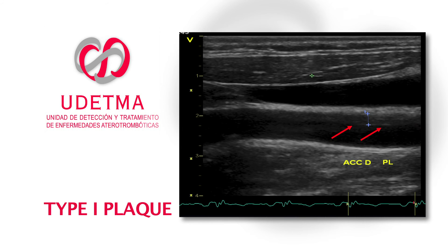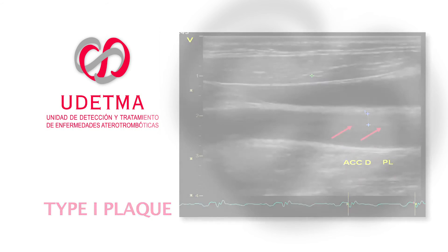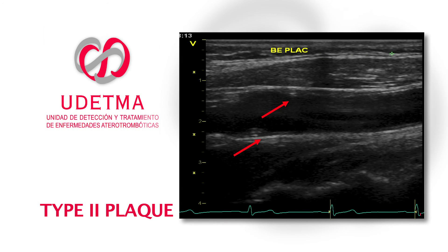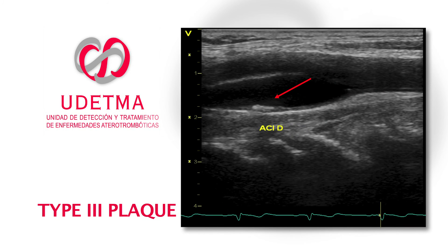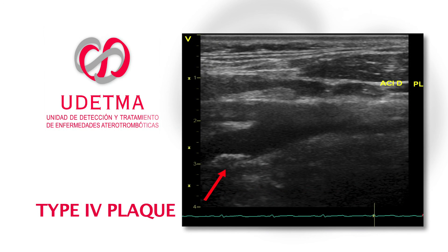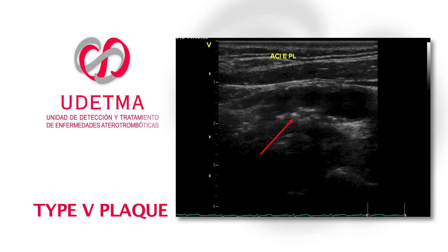Examples: Type 1 plaque on the anterior wall of the common carotid artery. Type 4 plaque on the posterior wall of the internal carotid artery. Type 5 plaque or calcification on the posterior wall of the internal carotid artery.